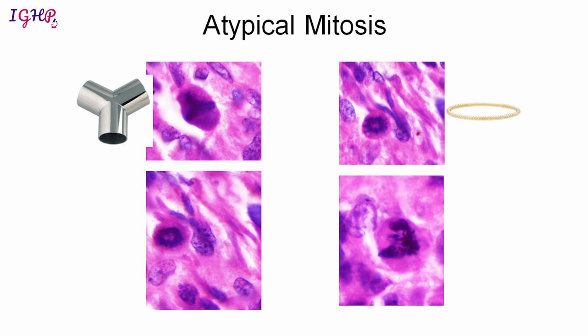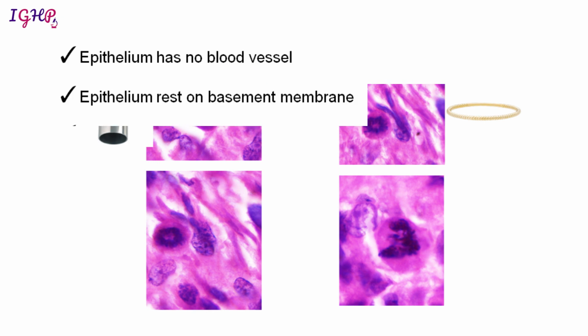So like this could be assumed as a dinosaur sitting. So this is a distinct type of mitosis, and they're all atypical mitosis that we see. So if you are finding any atypical mitosis, that means the lesion you are seeing is going in favor of a malignant neoplasm rather than a benign neoplasm. So that was about the mitosis part.